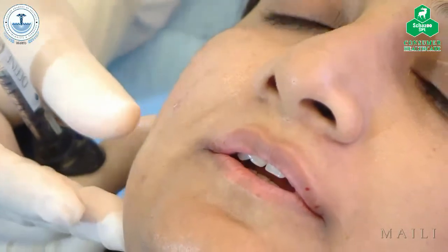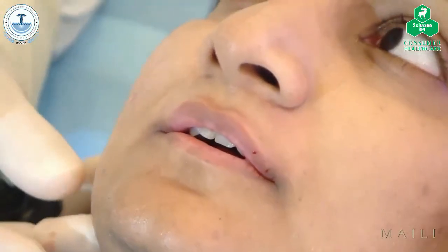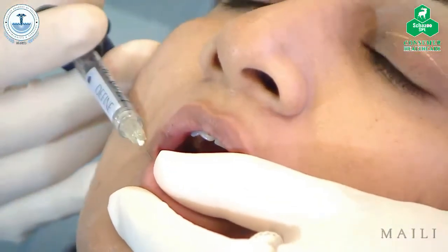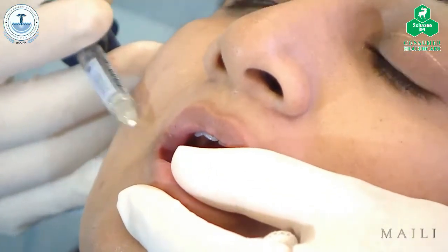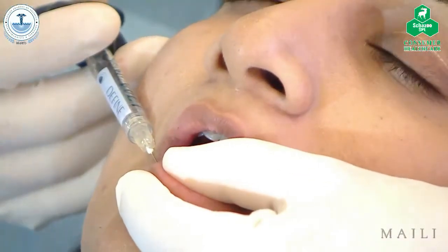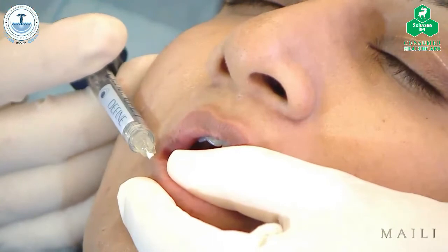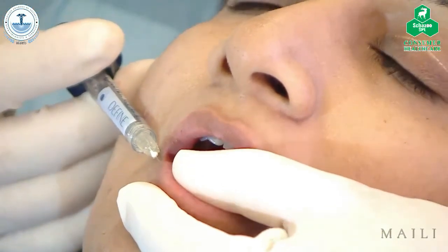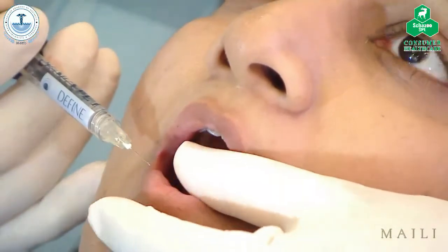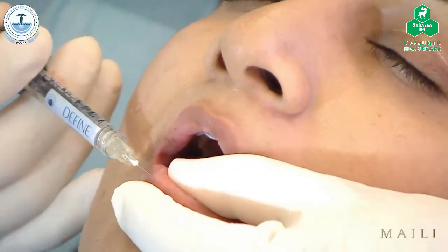Okay, now it's to balance the lower lip, and the lower lip is going to need more volume. So, a very classic way. Start more lateral on the lower lip because you can have more width. Just 2 lines, 1, 2, 3. Two vectors. Then I go more medially, and I'm going to do 3.